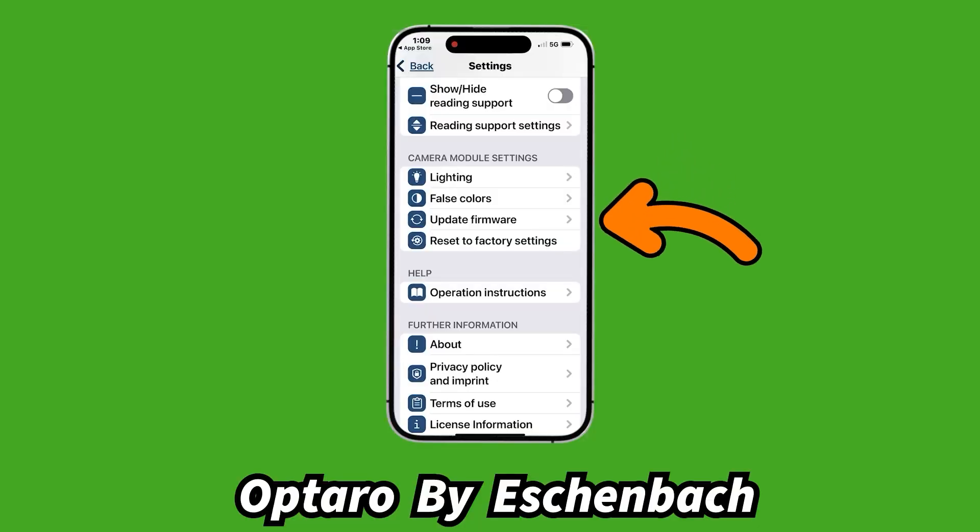There's also an update firmware option — since this uses an iPhone, it can connect to the internet and download firmware updates. You can also reset to factory settings, which is handy if you've changed things and it's not behaving as expected. The default settings are pretty well chosen, so you can pretty much take it out of the box and not worry about any of this.